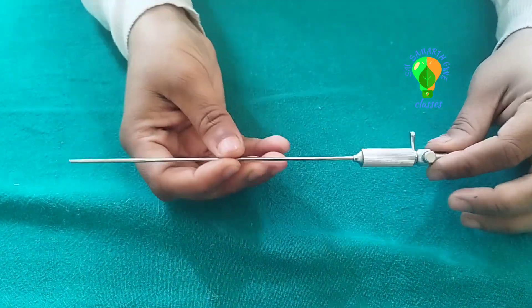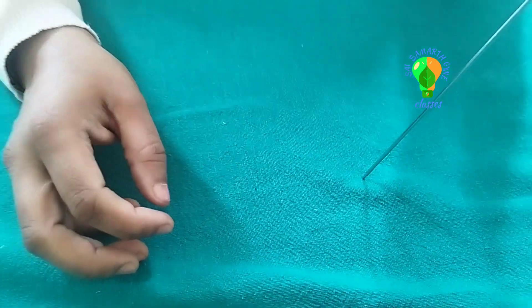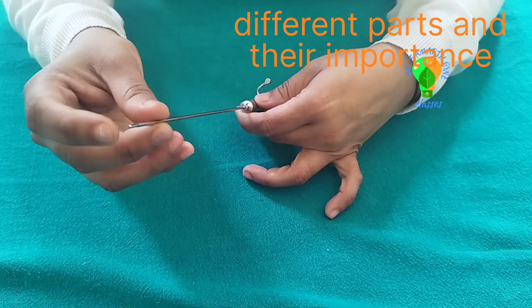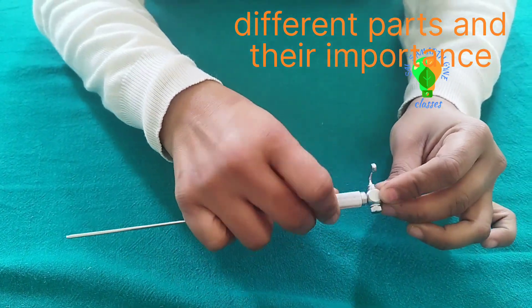This is the Veress Needle. There are two parts: there is a sharp part, and inside there is a blunt tip. It is a rod-like instrument called a stylet. I will open this and show it to you.